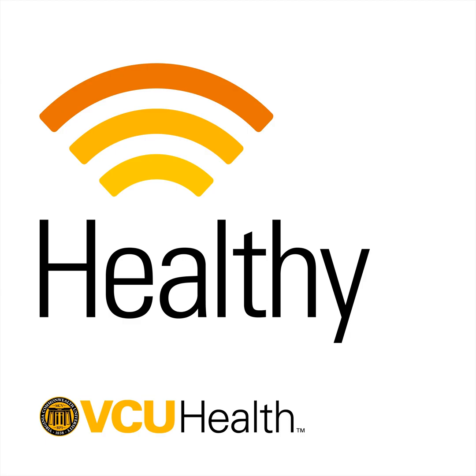Dr. Koch, I know how busy you are, but I have a final question for you. What does the future of focused ultrasound look like? Focused ultrasound for essential tremor is really the tip of the iceberg. As you can imagine, this is a technology that lets us safely and precisely disrupt a circuit in the brain. The ability to change the risk profile for something like that, where it doesn't involve major hospitalization, it doesn't involve having hardware implanted in your body, right? So deep brain stimulation has hardware that's implanted in the body that, because it's an artificial device, it has a rate of failure. When the battery runs low, it either needs to be charged or replaced, etc. So because we have that, it really opens the door to disrupting other types of circuits.